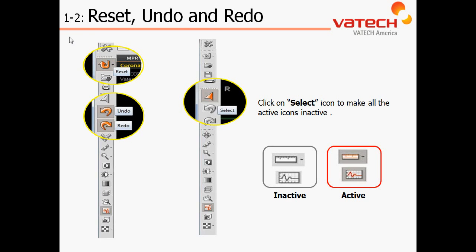Let's move on now to Chapter 1, Section 2: understanding the layout of our icons within the EZ3D software, including reset, undo, redo, as well as identifying inactive versus active buttons.